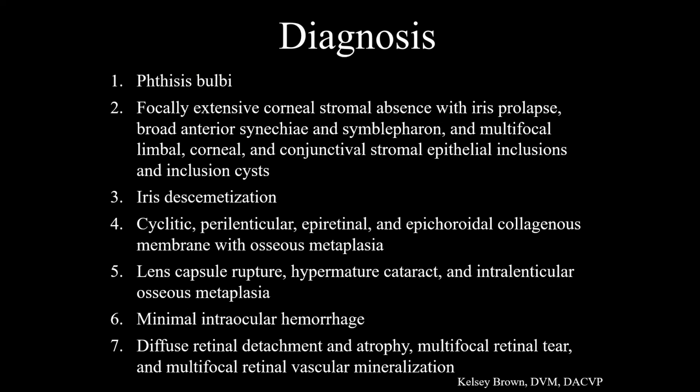Are there any questions, comments? I have one comment. Yes. This is a great case to illustrate how the post-traumatic osteosarcoma forms. Oh, yes. Thank you. I was going to mention that. This is just such a beautiful case of osseous metaplasia associated with lens capsule rupture, like cataract and lens capsule rupture, but it just takes one step further for that to become a tumor. So it's really cool. Absolutely. Thank you. That was totally in my head to mention, and then I got all distracted. All right, great. It was a good one too, because grossly we mentioned that it felt very crunchy cutting into it. So we have a good correlate to that.